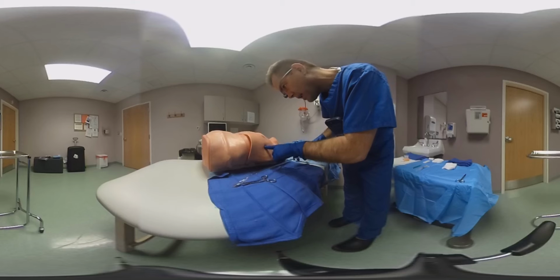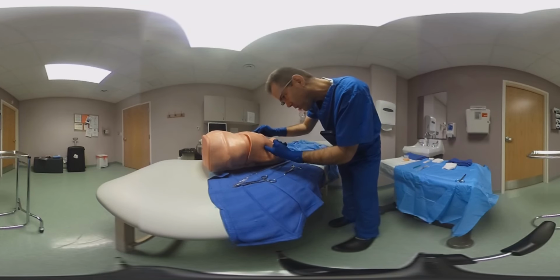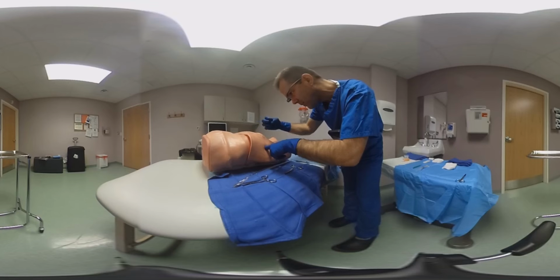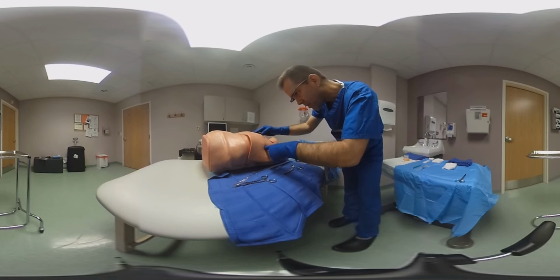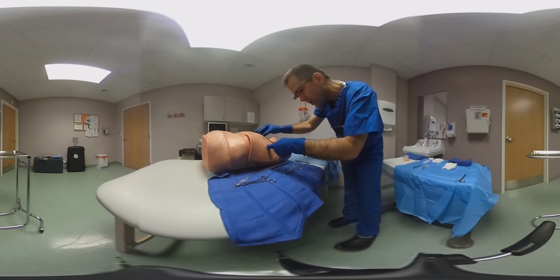And once you're in, you want to put your finger and do a digital exploration so that you can see that there are no adhesions between the actual lung that it's inflating and the parietal pleura. And once you confirm that, you actually feel the lung inflating against the tip of your finger.